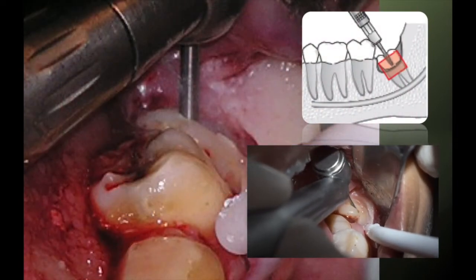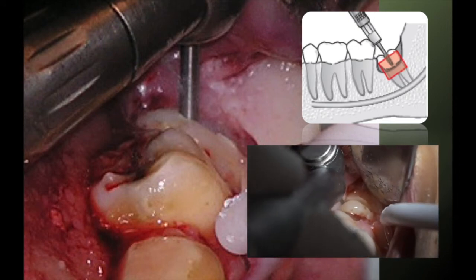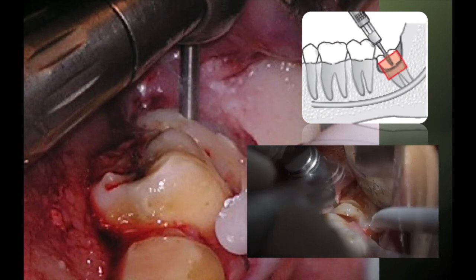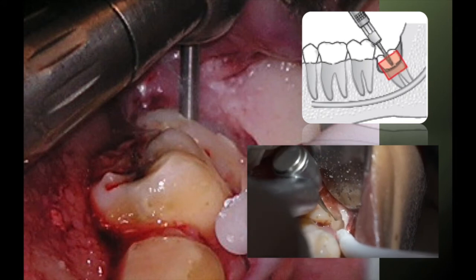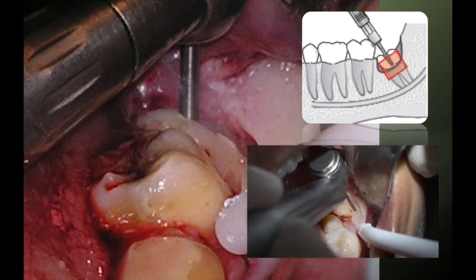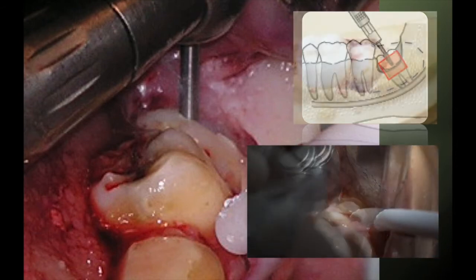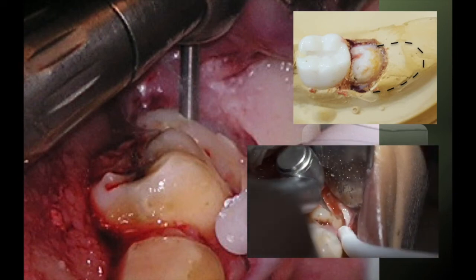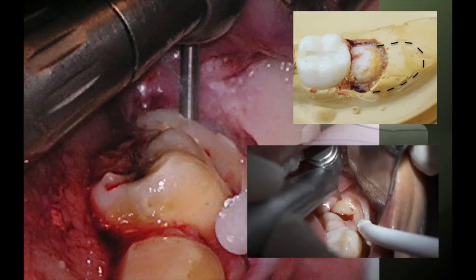We would like to use sharp carbide burs of adequate size and shape under copious irrigation. Just as with bone removal, there are other instruments that can be used for tooth sectioning as well. We never cut through and through; we leave a thinned out portion of the enamel on the lingual and inferior aspect of the impacted tooth. This is to protect the structures beyond them.